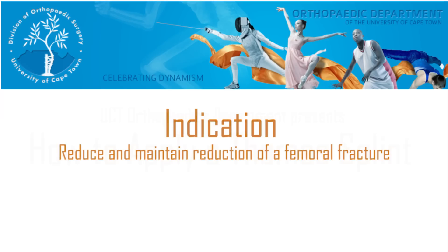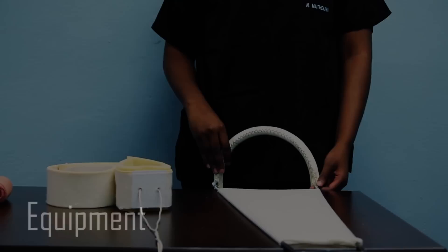This video will demonstrate how to apply a Thomas splint, which should be applied on femur shaft and distal femur fractures — not for neck of femur fractures.